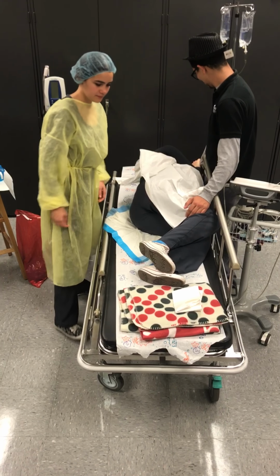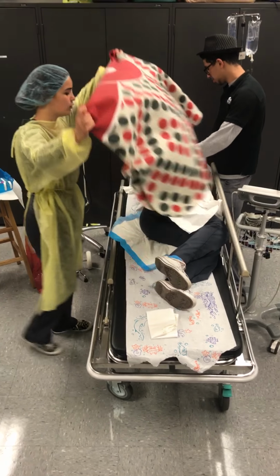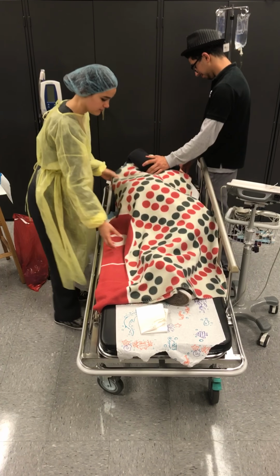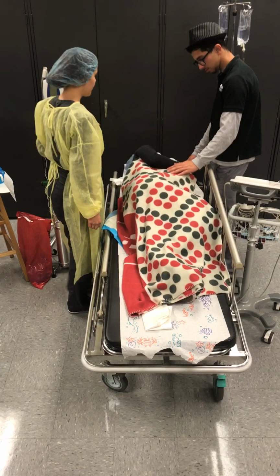Drape the patient for warmth and privacy. It's okay. It's all going to be over soon, alright? Instruct the patient and the father to help the mother draw the knees to the abdomen and to grasp the knees to hold them in place.